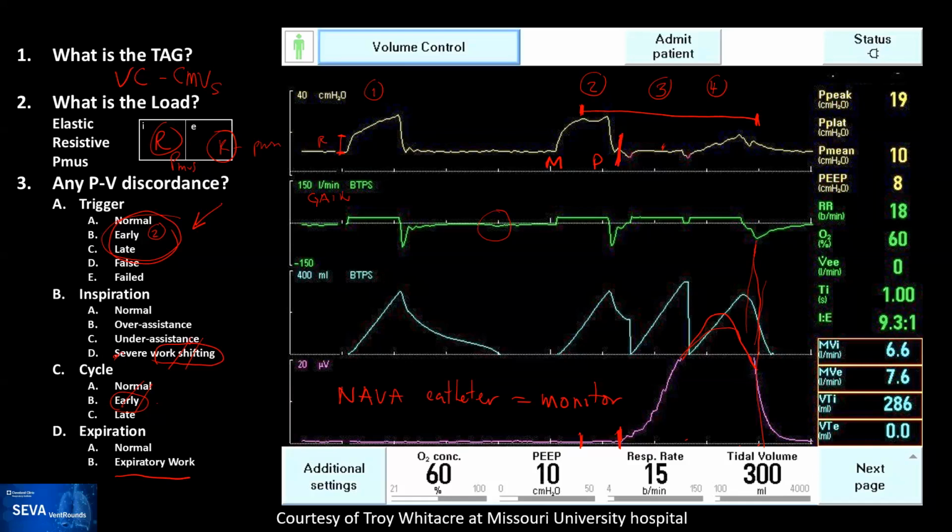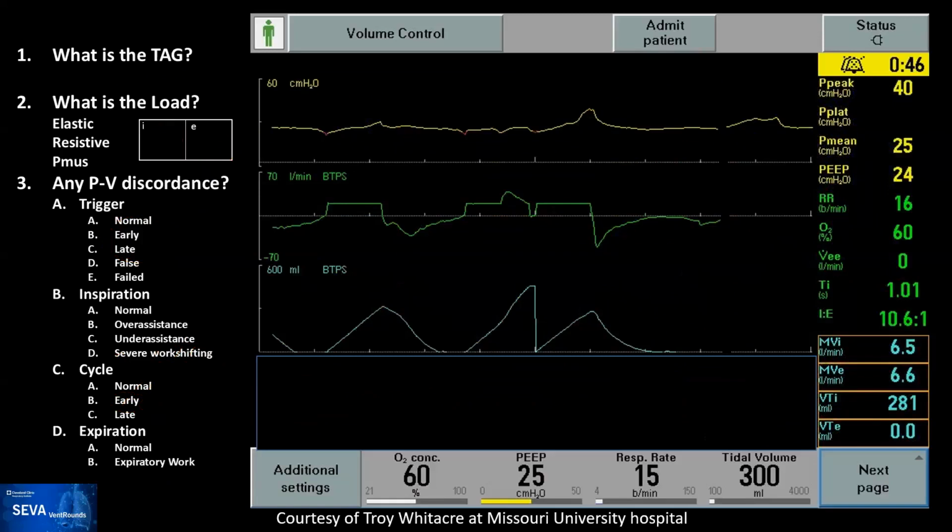Thank you very much, Troy. Really a good image. I'll show the next one because this one is another one. And actually, this has a little bit more information about a different tag for the ventilator.